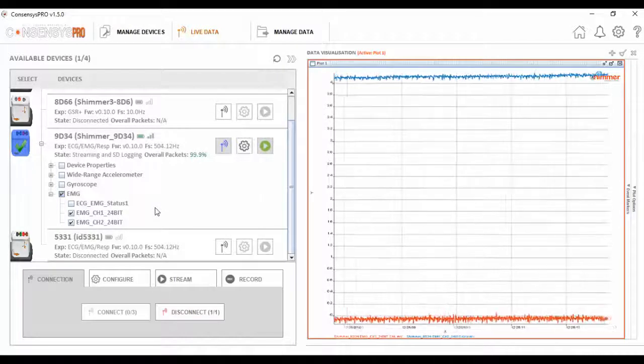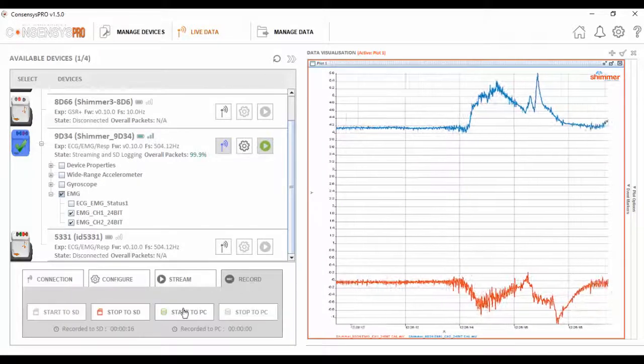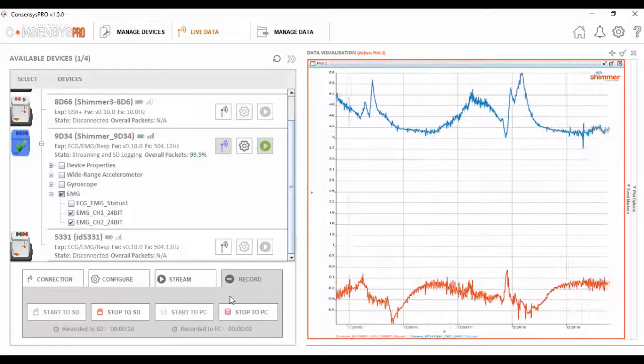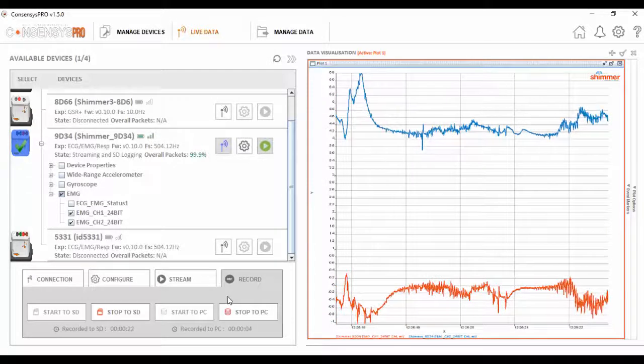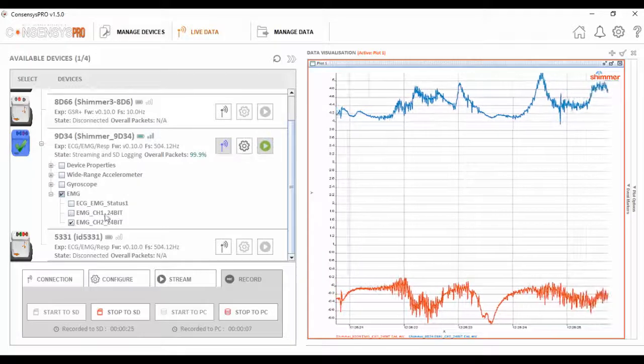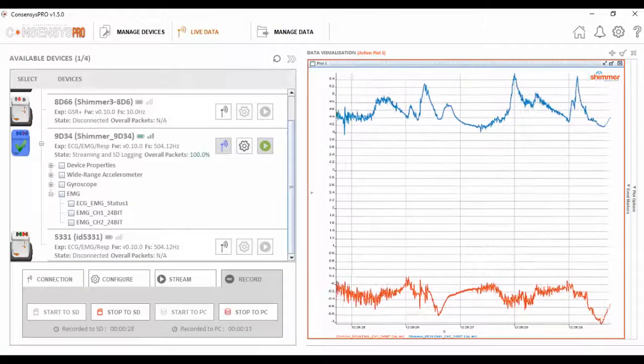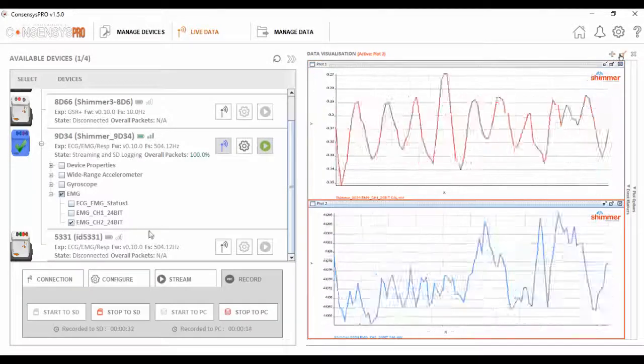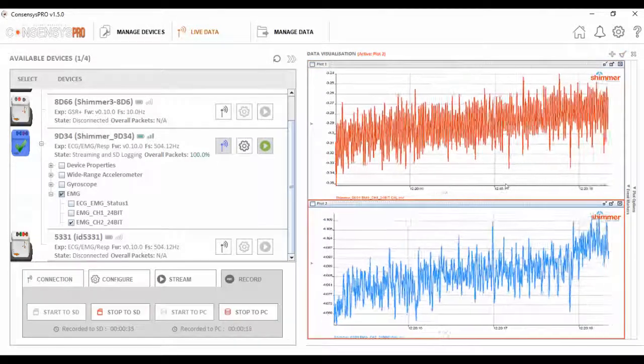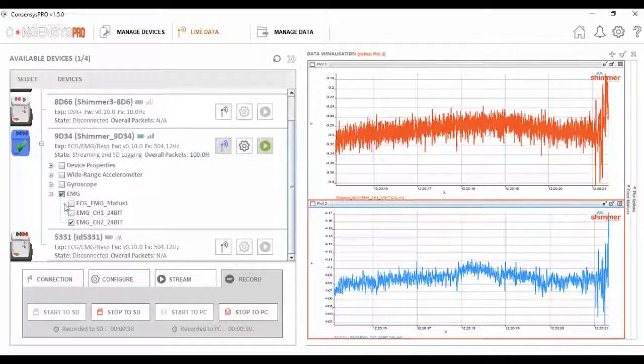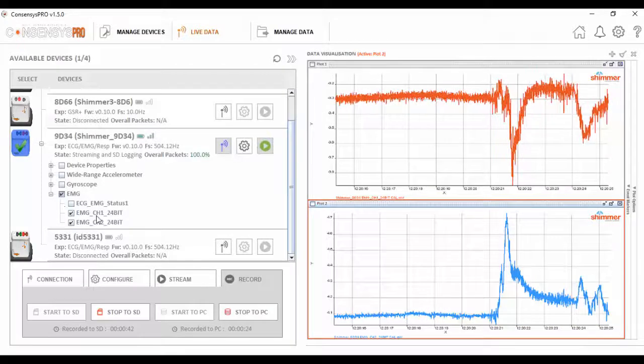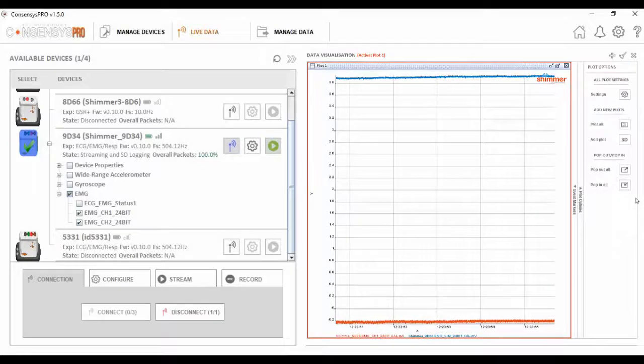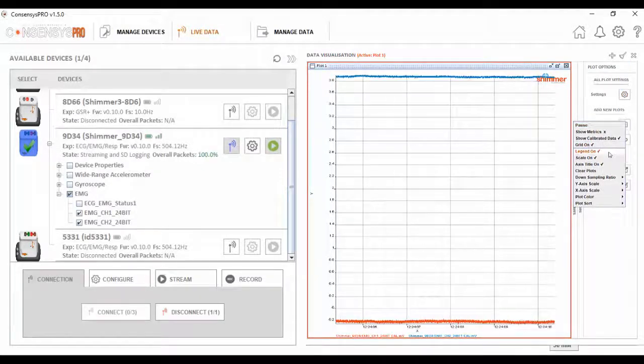As we discussed, these units are currently logging data. To record live data locally to the PC, I simply select the units and press record down below. There are a number of different options for plotting signals. We can have all signals on one plot, or we can have different signals on different plots as we wish. The plot settings can also be configured to your needs, such as changing the X and Y axis scale range.